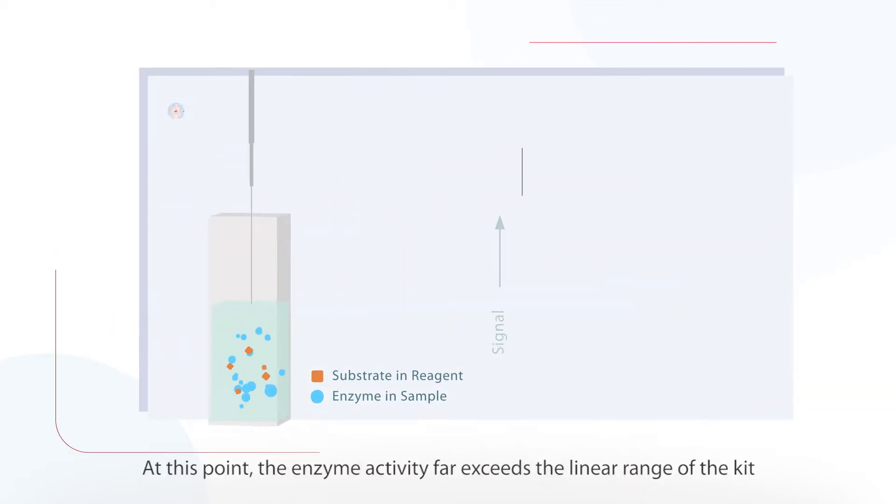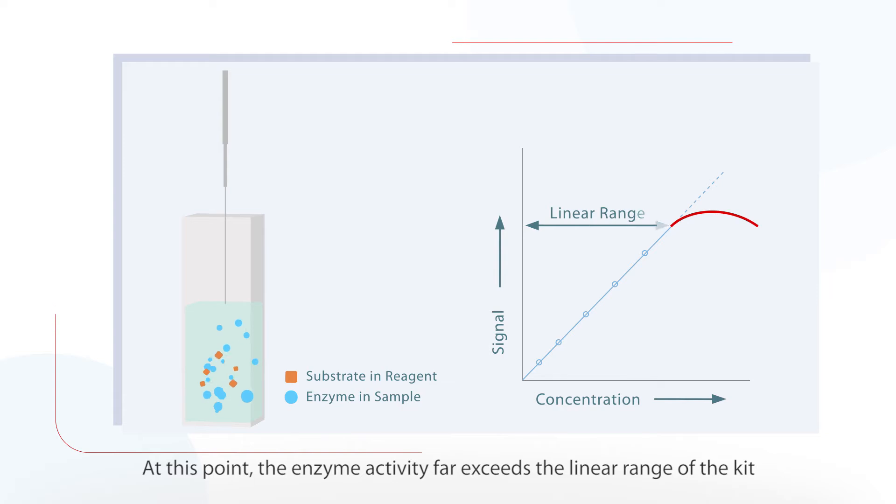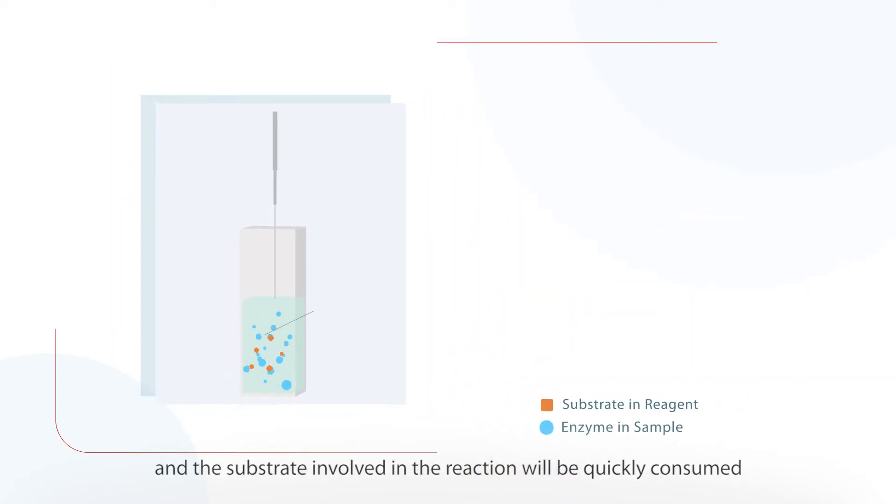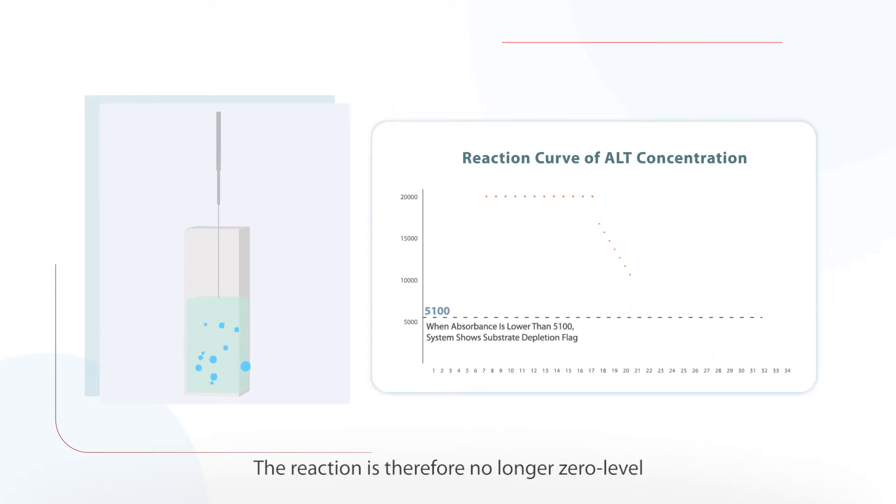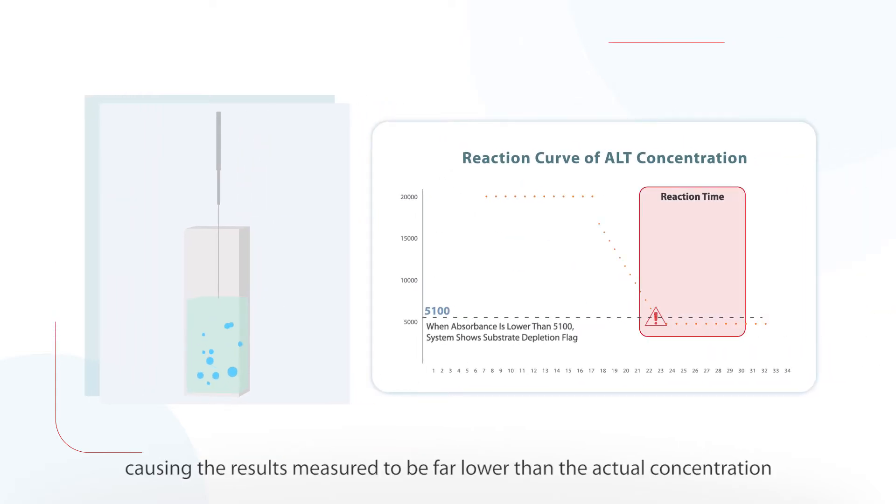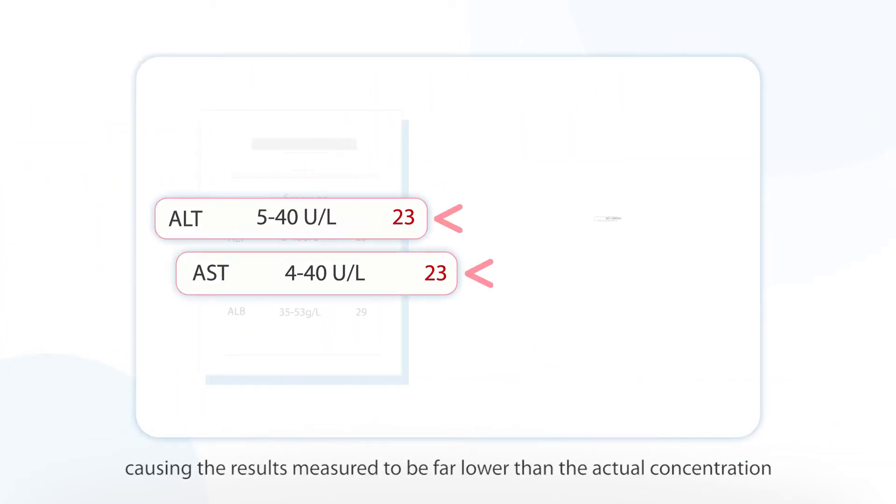At this point the enzyme activity far exceeds the linear range of the kit and the substrate involved in the reaction will be quickly consumed. The reaction is therefore no longer zero level causing the results measured to be far lower than the actual concentration.